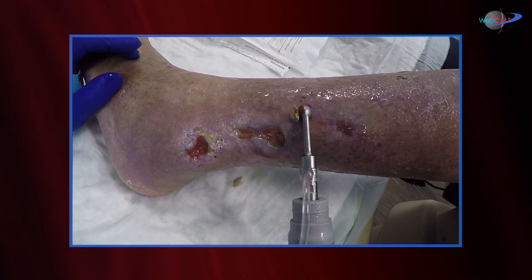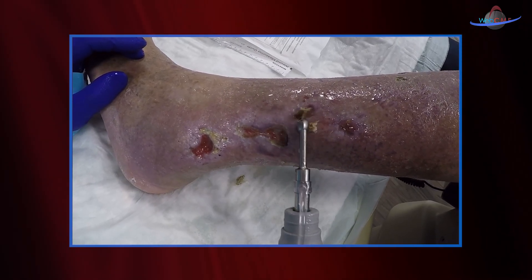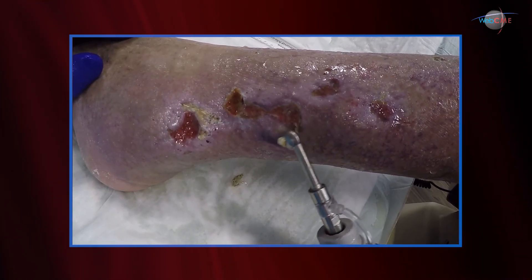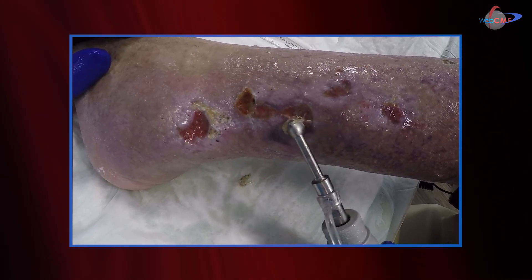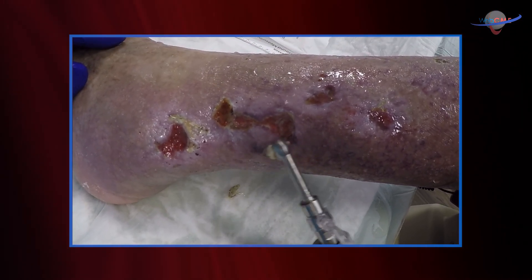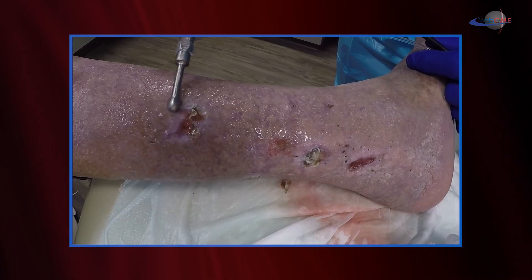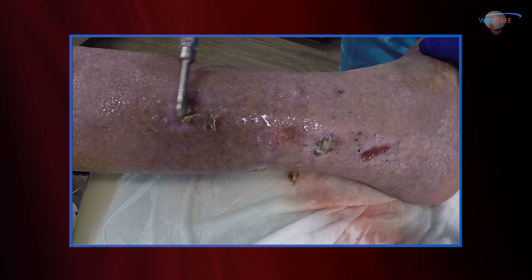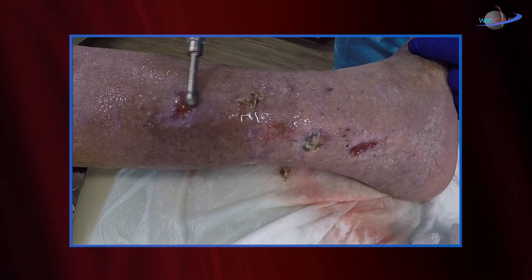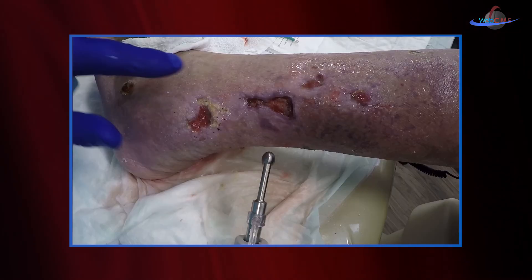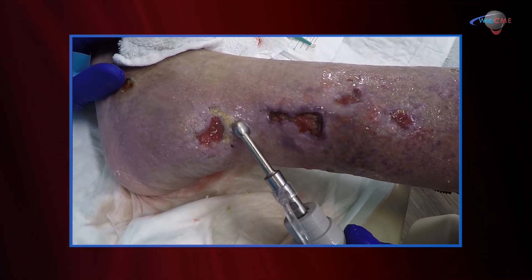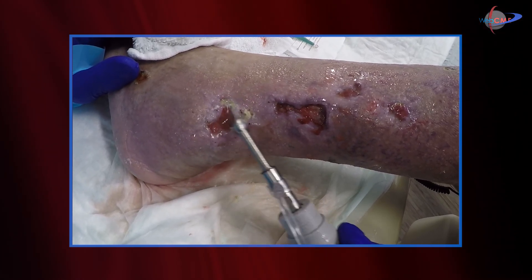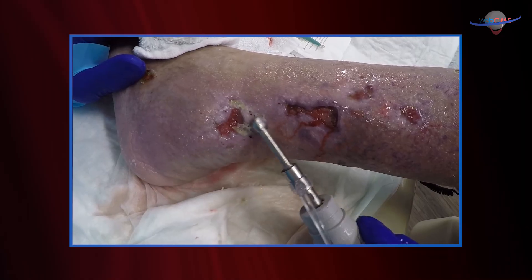So now we're going to go ahead and debride the other wounds. Again, I'm using the same technique — I'm going to sonicate the tissue and let the ultrasonic energy provide acoustic streaming and cavitation. Cavitation is what kills the bacteria. Then after I've sonicated the tissue, I come back with the edge of a curette for the debridement. You see how we're just taking that eschar, that slough, right off the wound base. See the crusting? We're going to sonicate all of that. As you sonicate it, it loosens. You come right with the edge of the curette and just scrape it off. It loosens very nicely.